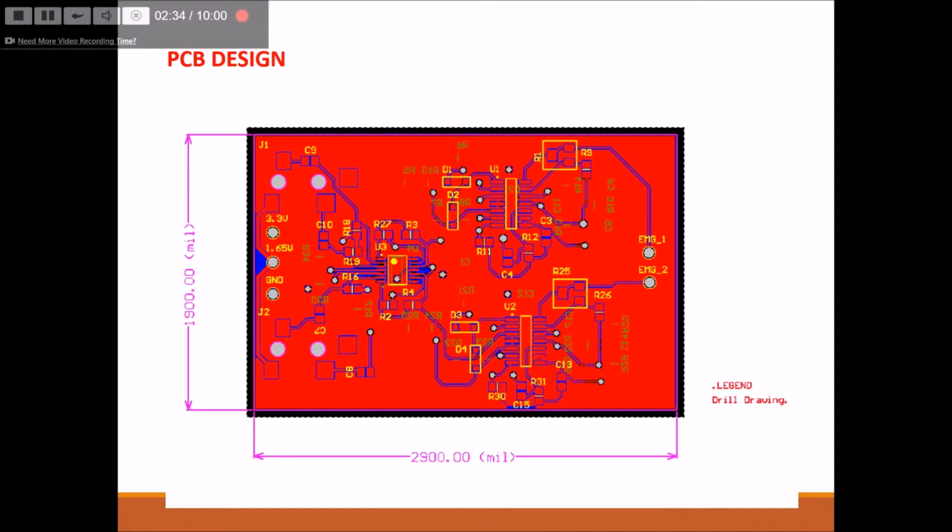Here's a picture of our PCB design that we made in Altium as well. The PCB was 2 inches by 3 inches, and you can see that again the circuits are mirrored at the top and bottom. It is a two-sided board with the power plane or VCC on top and ground on the bottom. Unfortunately, we had some issues with the manufacturer and our PCB did not get shipped in time to have it ready for the demonstration.